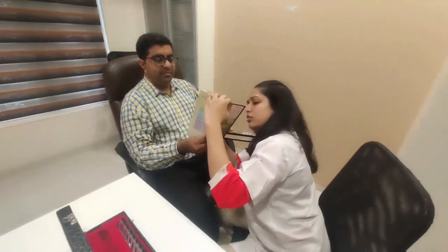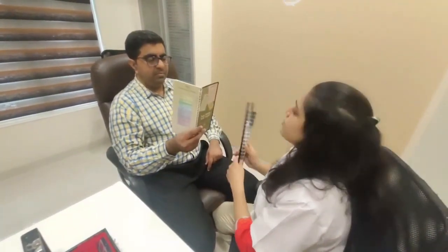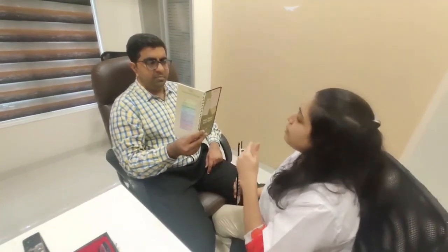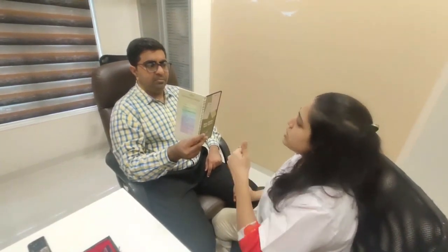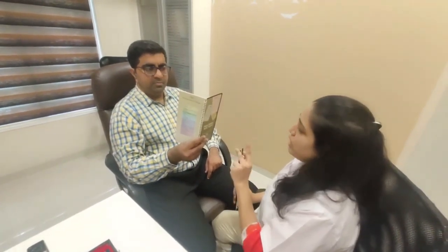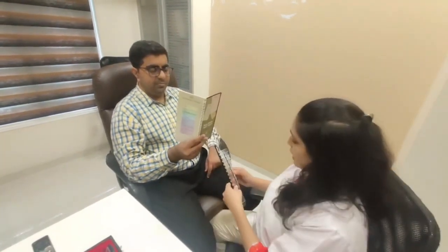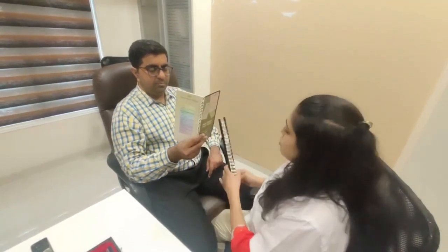Please look at the words written here. Okay, I will put these prisms in front of your eyes. Initially the vision will become blur, then it will become double, and then again it will become clear. When you first notice the blur, you have to tell me. Then when it appears to be 2, you have to tell me, and when it becomes clear, please let me know. Okay, we'll begin with negative fusional Vergence, where we will put the base in, that is towards the nose.